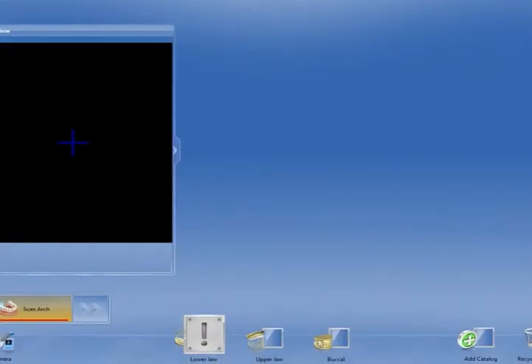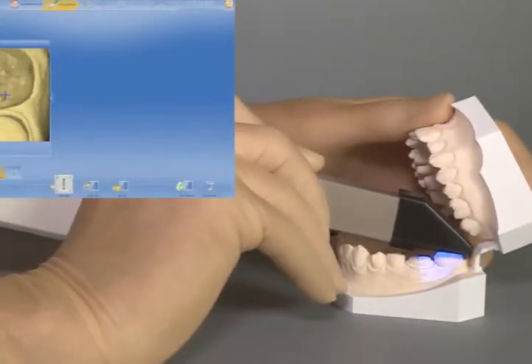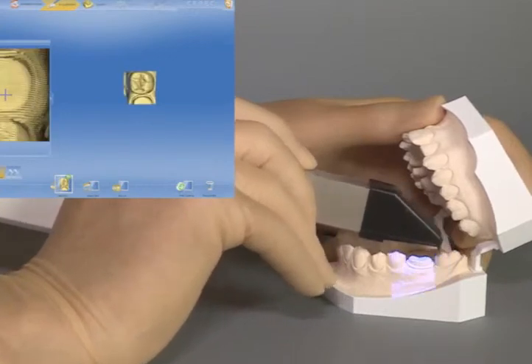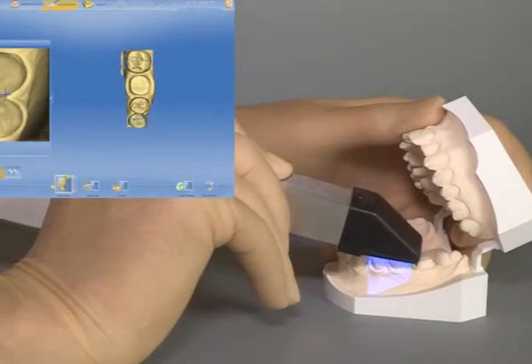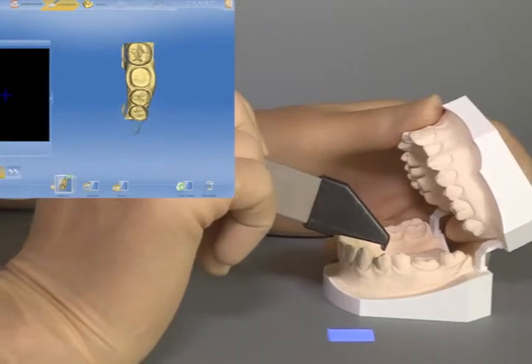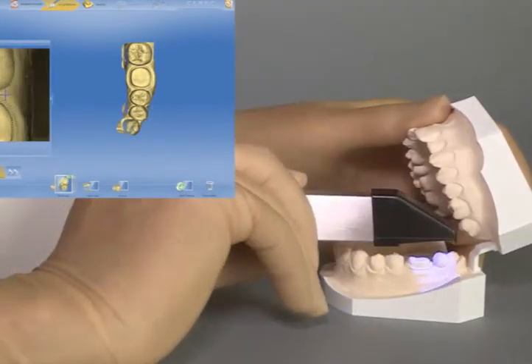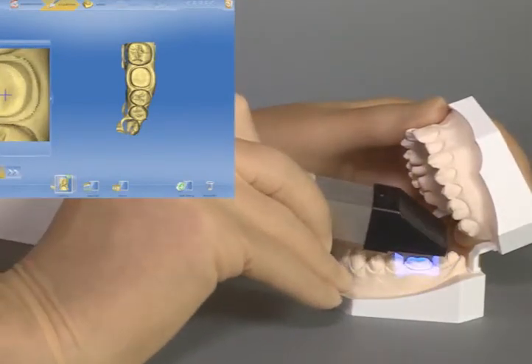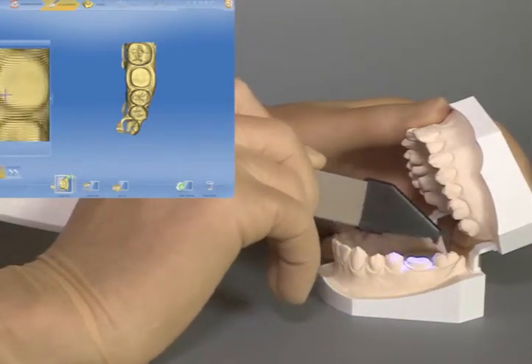We are now in acquisition mode for the lower jaw. We commence scanning from distal on tooth 3/7 with overlapping scans forward to mesial. In the premolar area, we tilt the camera slightly buccal-caudal to ensure we capture sufficient buccal facial surface for buccal bite registration. We scan the proximal contacts of the neighboring teeth so that any undercuts are also shown. This facilitates a better design of the interproximal area.